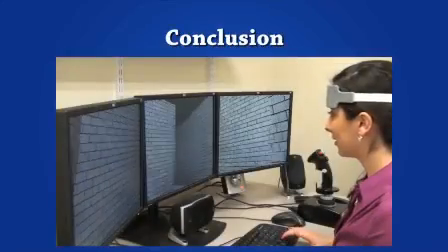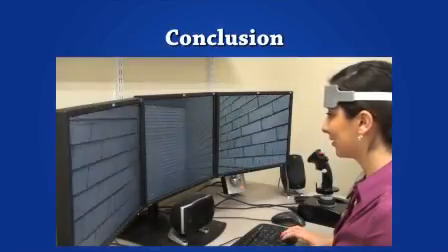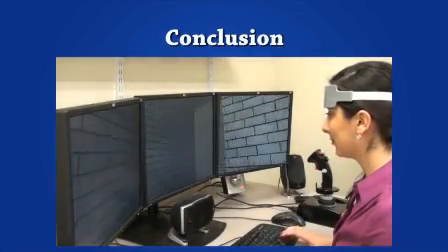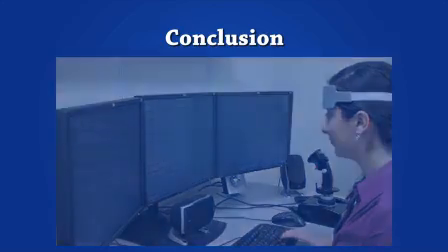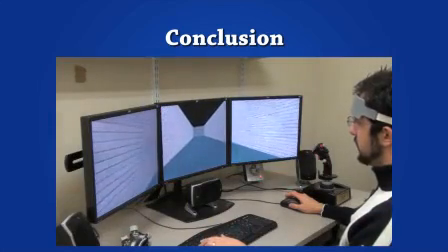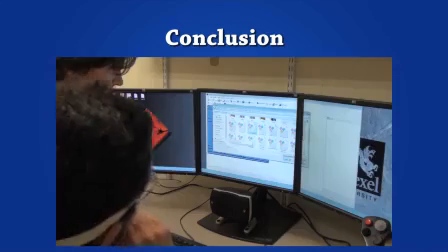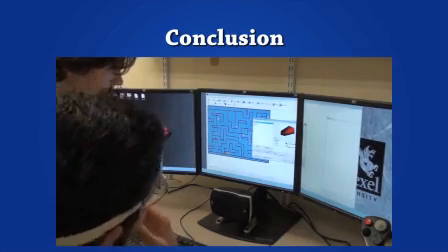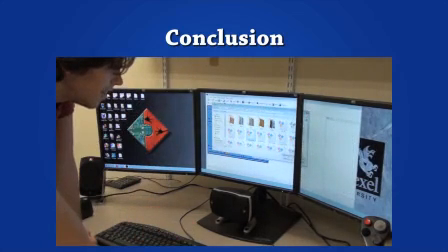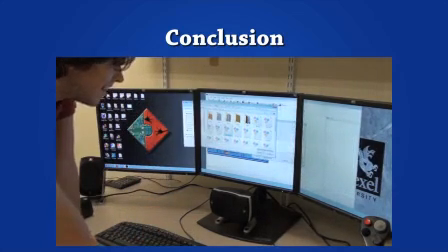In conclusion, this exploratory study demonstrated the use of Maze Suite and fNIR to study neurobehavioral aspects of learning in spatial navigation. Maze Suite enables the design and application of simple 3D environments with a user-friendly graphical interface, and it automatically records behavioral measures for within subject or across subject comparisons.